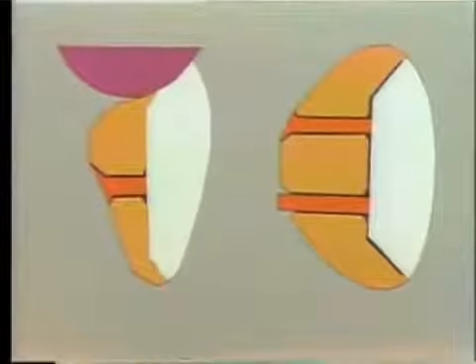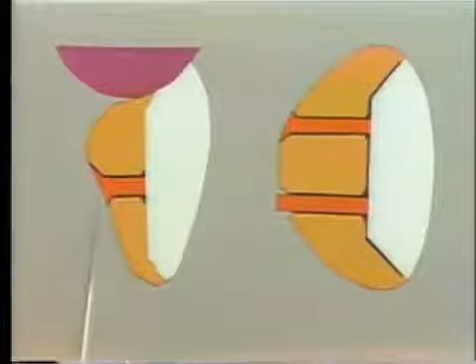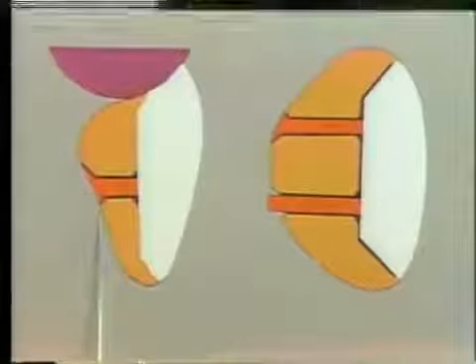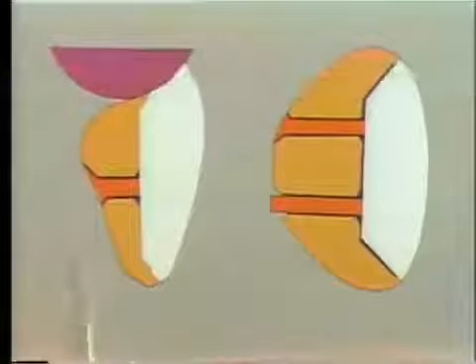Let's take a look at a diagram which shows the relationship of the porcelain facing to the gold backing. In the diagram over on the left-hand side of the screen, the gold coloring represents the gold backing of the Pontic, and the white area is the porcelain facing. You can see the pins projecting through here from the back of the porcelain and running through to the gold. This is cemented in position once the gold backing has been made, and the ends of the pin are ground over to give this rivet-like adaptation to the gold backing of the porcelain.